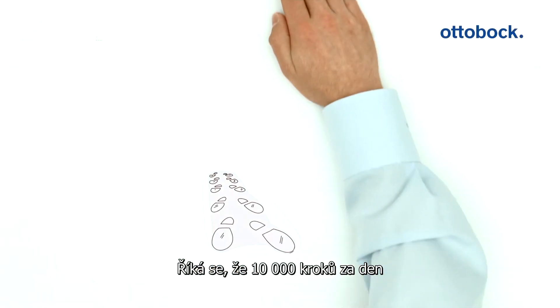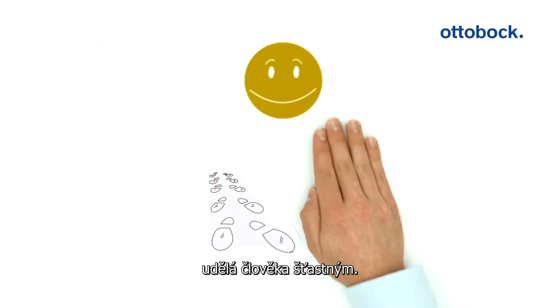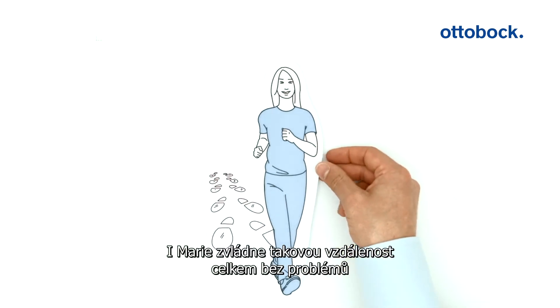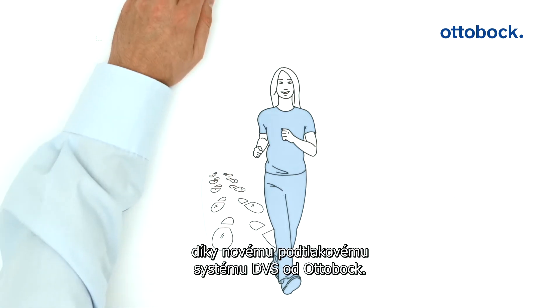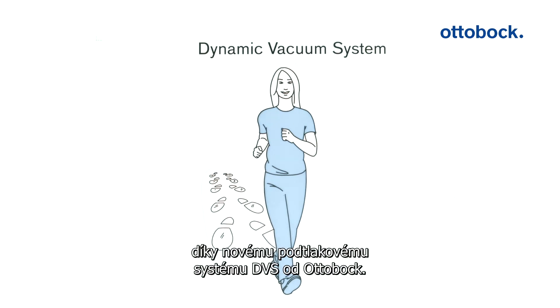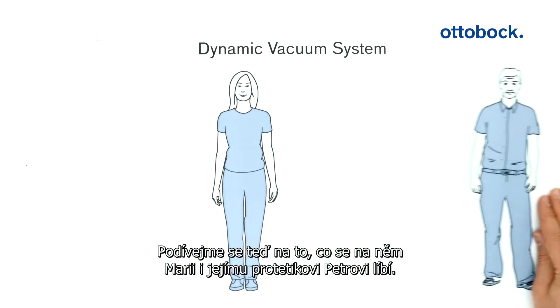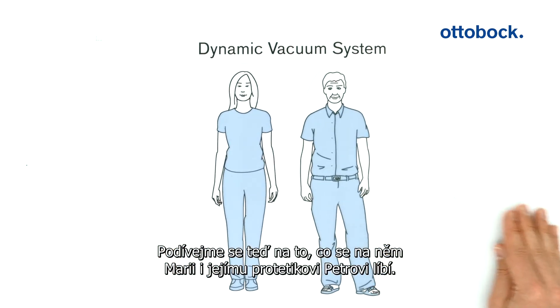10,000 steps a day make you happy, they say. Maria also covers these distances quite buoyantly, thanks to the new dynamic vacuum system from Ottobock. We'll now look together at why both Maria and her prosthetist Peter are excited about it.